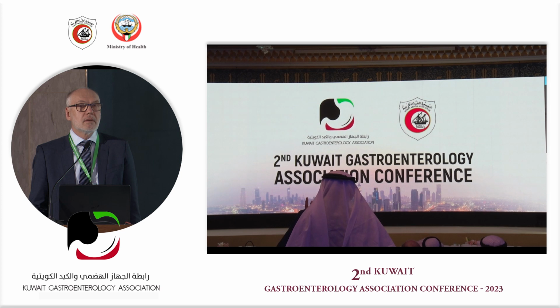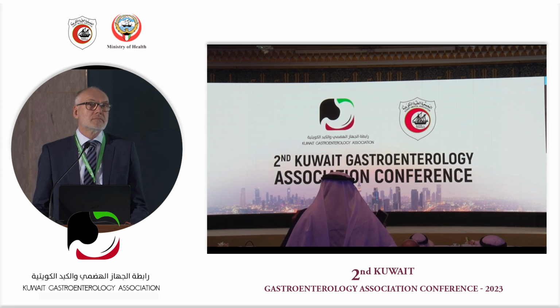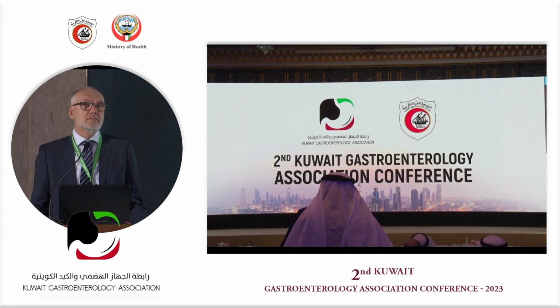The second most important question for me, as I'm working in a bariatric center, is the gastric sleeve leak. We have this big hole, and then you decide, shall I try Ovesco, or shall I put 3-4 pigtails, or just put a mega stent? Can you tell us how you decide, by the size of the leak, whether to put the Ovesco, or go with the stent, or go with 4 or 5 pigtails in the leak?